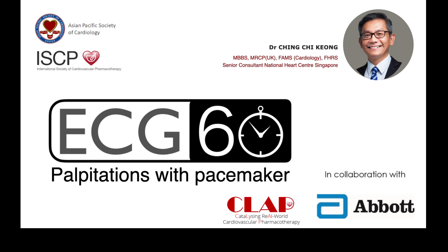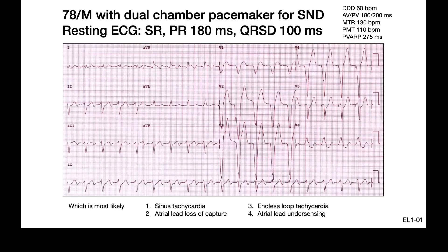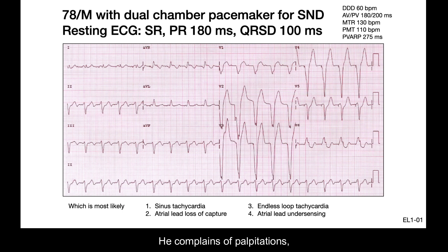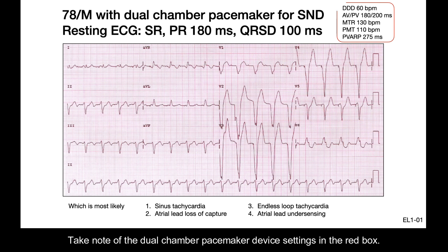This is ECG in 60 seconds. A 78-year-old man with a dual chamber pacemaker for sinus node dysfunction complains of palpitations, and this is a resting ECG recorded. Take note of the dual chamber pacemaker device settings in the red box.